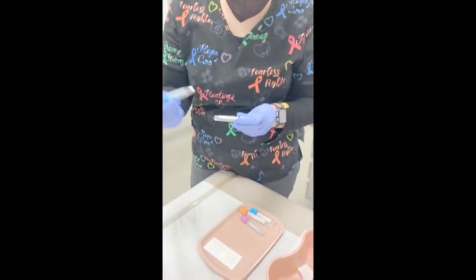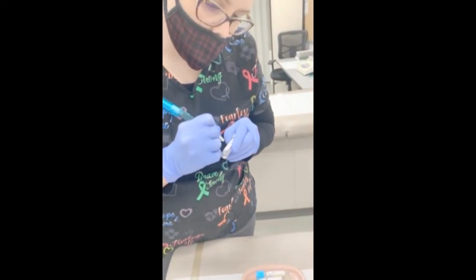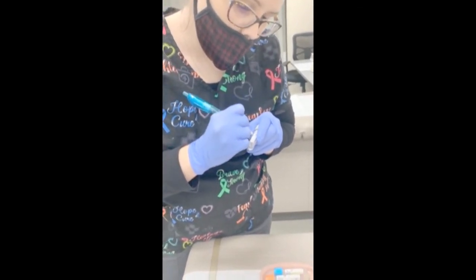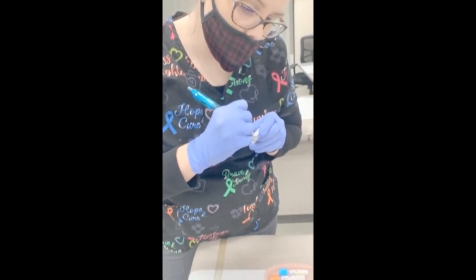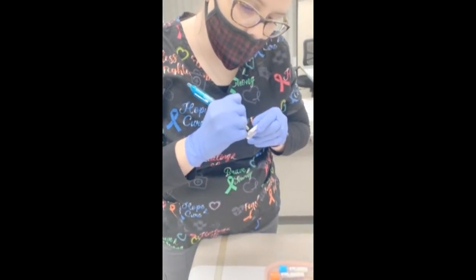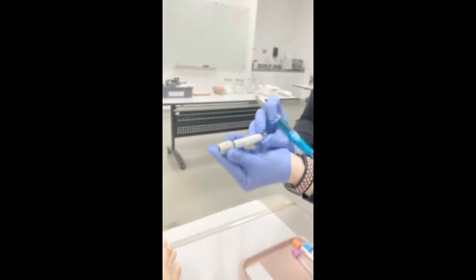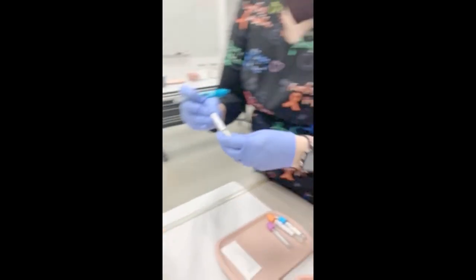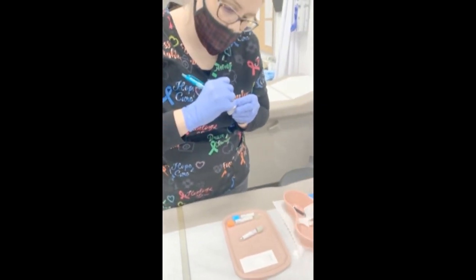Mr. Barnes, I'm going to go ahead and label your tubes. Always label the tubes right in front of the patient: last name, first name, date of birth, today's date, the time it was collected, and my initials. Mr. Barnes, can you go ahead and verify this information for me please? Perfect. I'm going to go ahead and write it on all of these. Go ahead and keep holding pressure.